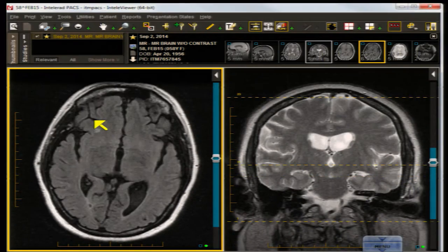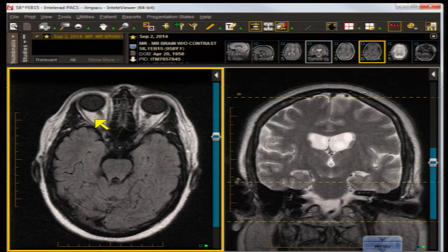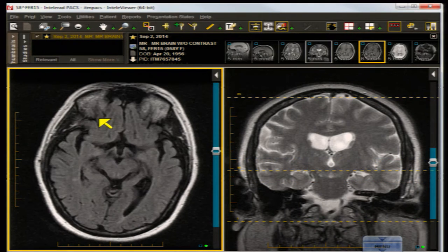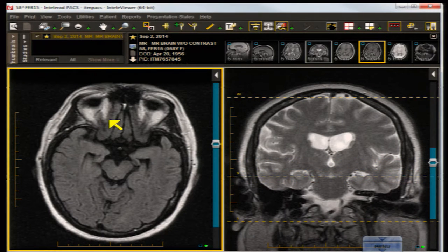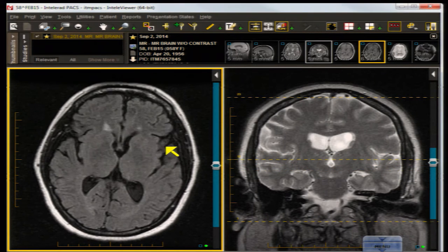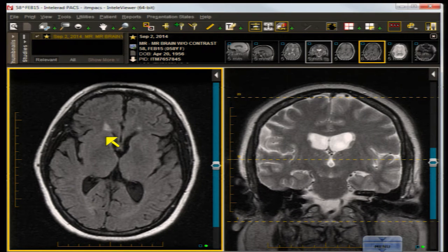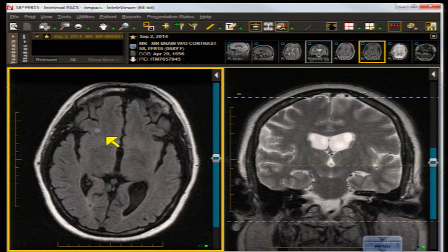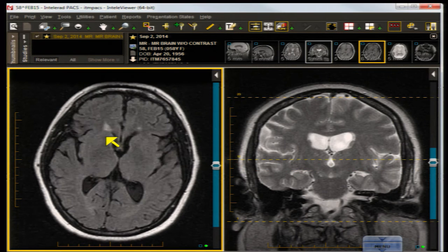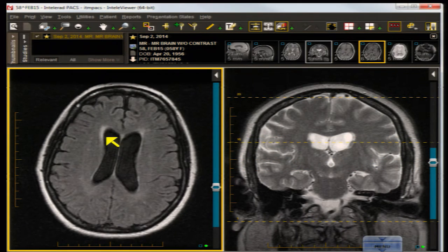Let's focus on the speech disturbance for a moment. We are looking for an infarct in the speech area, more often in the left temporal region. We see none on the FLAIR, although there are scattered areas of periventricular white matter disease, not uncommon in middle-aged adults — probably a few more volumetrically than we would expect, but not a macro infarction.